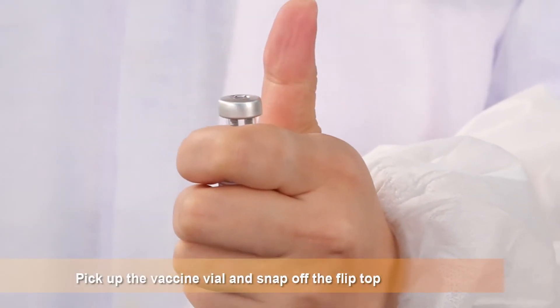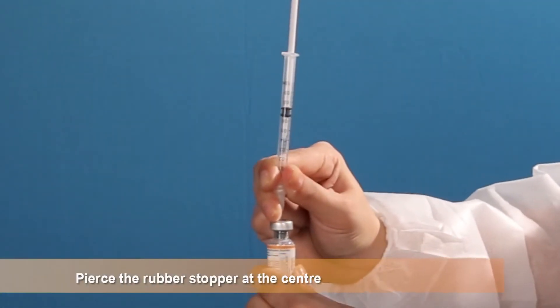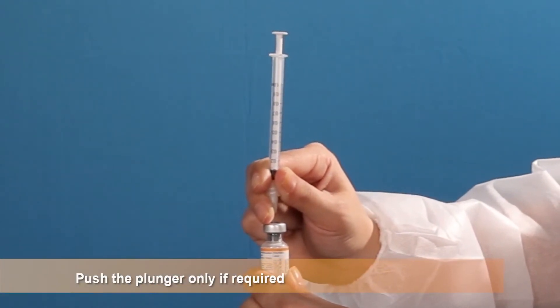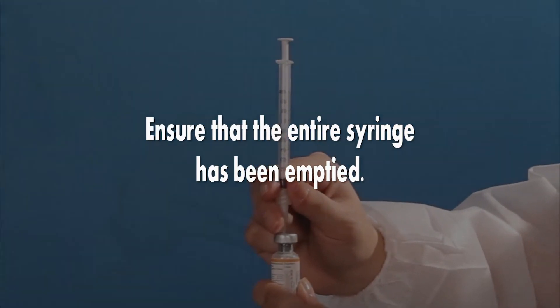Pick up the vaccine vial and snap off the flip top. Pierce the rubber stopper in the center. Allow the water to be drawn into the vial. Push the plunger only if required. Ensure that the entire syringe has been emptied.